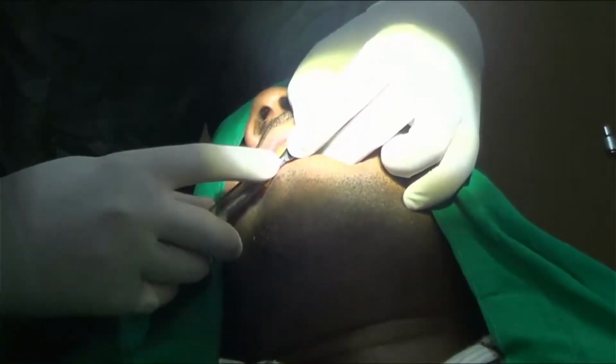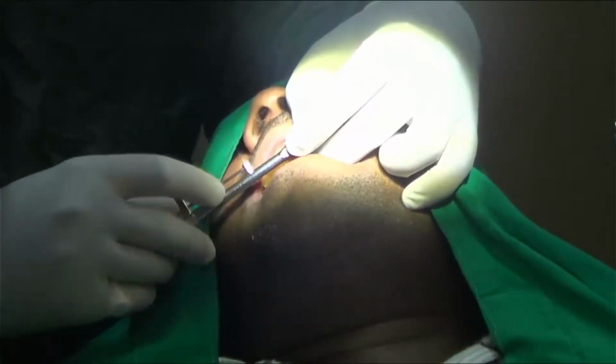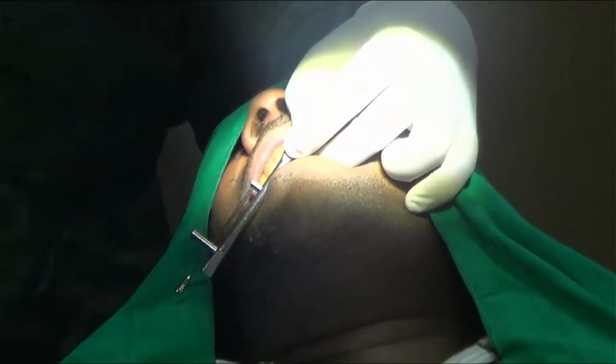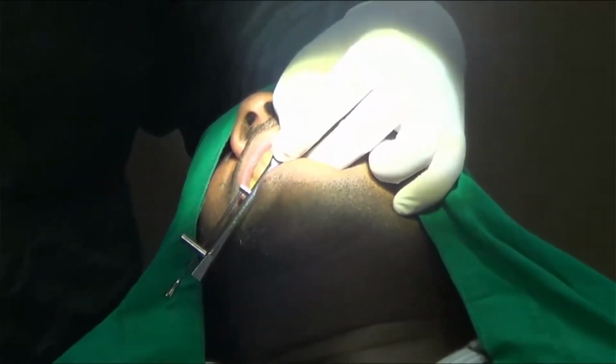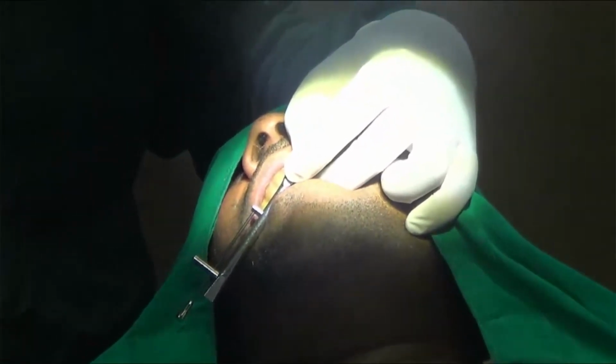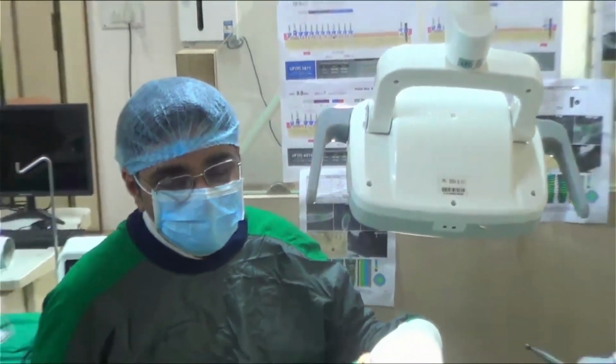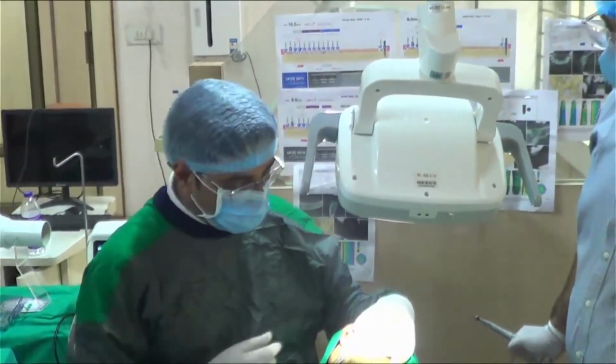We will wait. Never be hurried in this part, okay? Because this is how you are controlling the torque value and any kind of heating. Any kind of over compression on the bone can cause bone necrosis, that we should avoid.